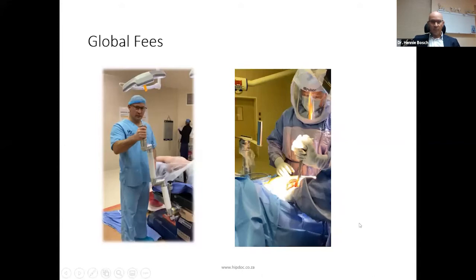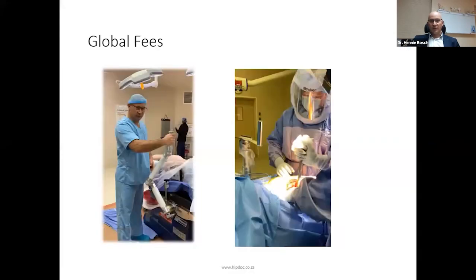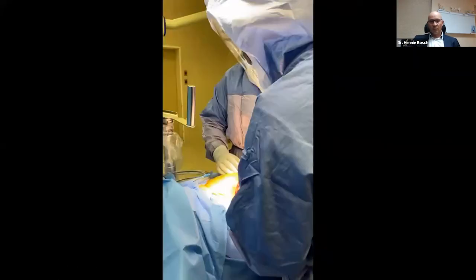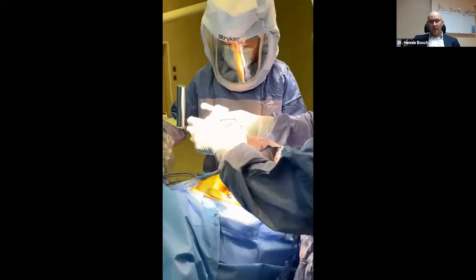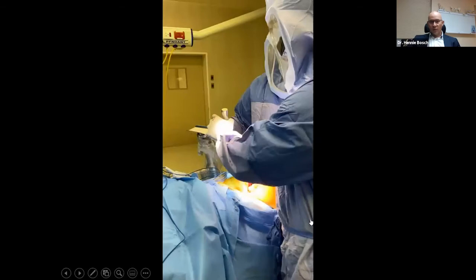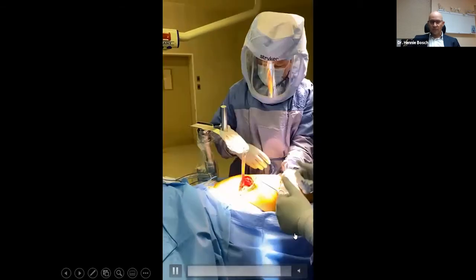this micro hip. So I walked into the shoulder surgeon's theater and realized they've got a nice arm which is for free. They are using it, and I can just go and get it. You just have to sterilize that part, and that piece of plastic on this area cost 80 Rand. So now I just take a normal swab and tie it around that thing, and I have another assistant which doesn't get tired and doesn't cost any money, or 80 Rand, I guess. And I can manipulate exactly where I want it.